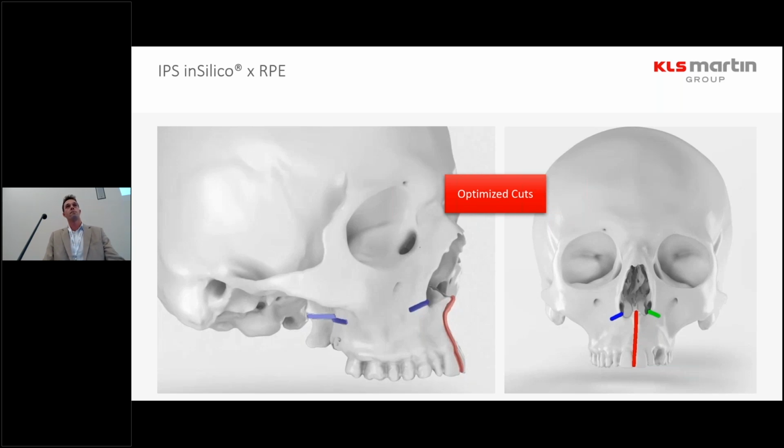So in web meetings, our IPS engineers define where those cuts need to be. So roughly, from the height. Then we are simulating those 100 results. We are coming back with 5 results that are possible or that will create a symmetric widening.